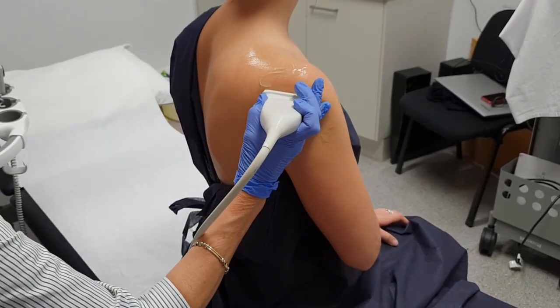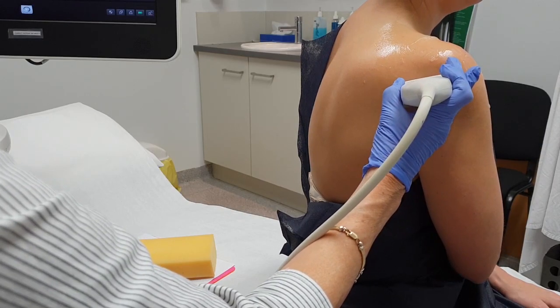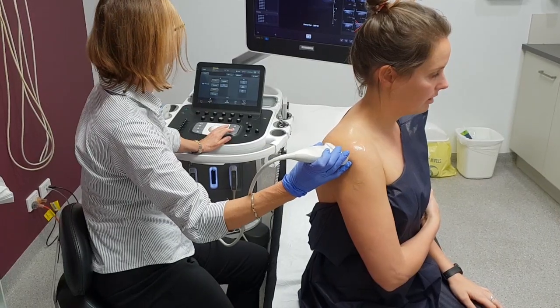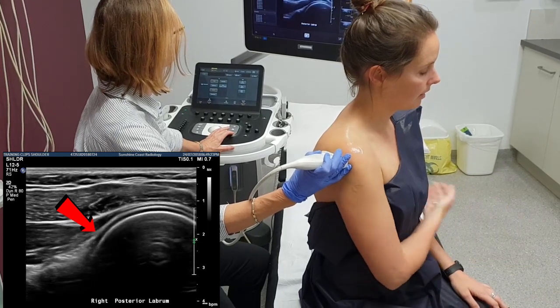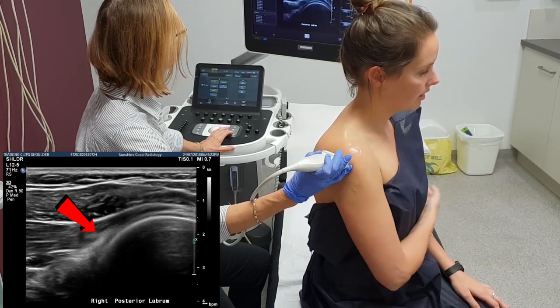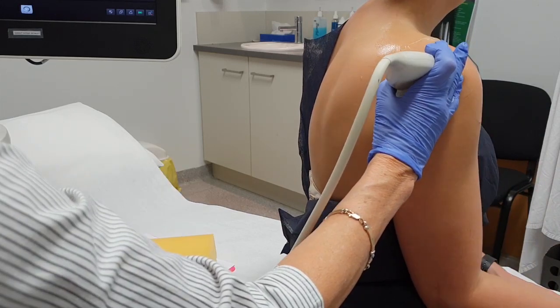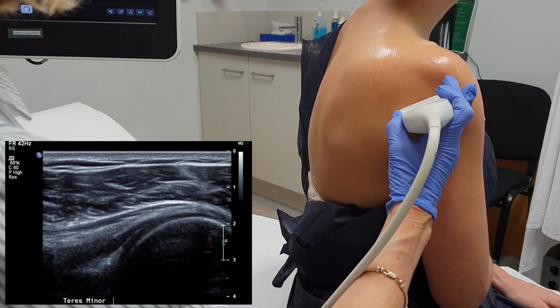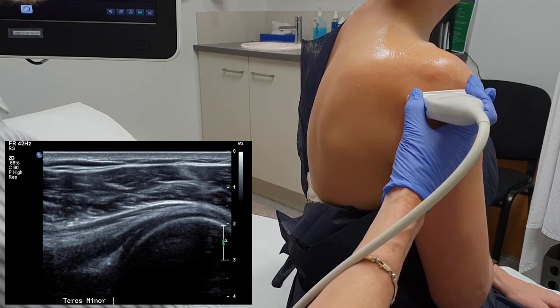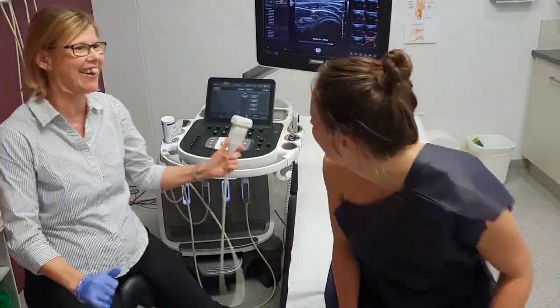I examine the infraspinatus — you don't often see anything in the infraspinatus. Then you just come around to the back of the shoulder and have a little look at the posterior labrum. Get the patient to move their arm backwards and forwards. If you're suspicious that there might be a frozen shoulder, this movement is an excellent one to see cartilage moving nicely. Then I just move down a little bit. If you're going to look at the teres, remember it is quite a long way back — a lot of people mistake the infraspinatus and call it the teres. And that's the end of a shoulder examination.